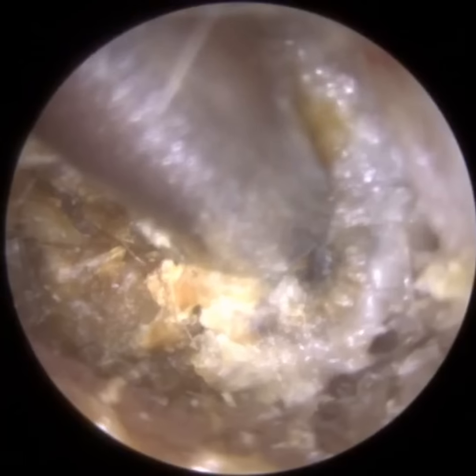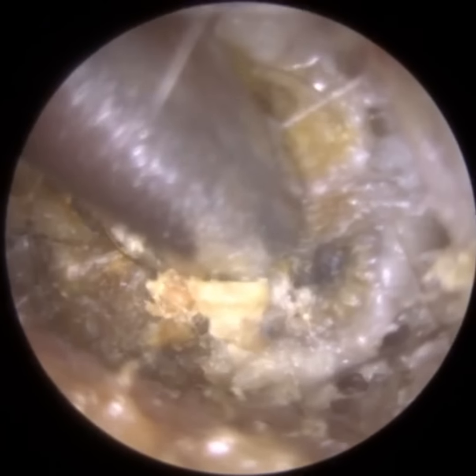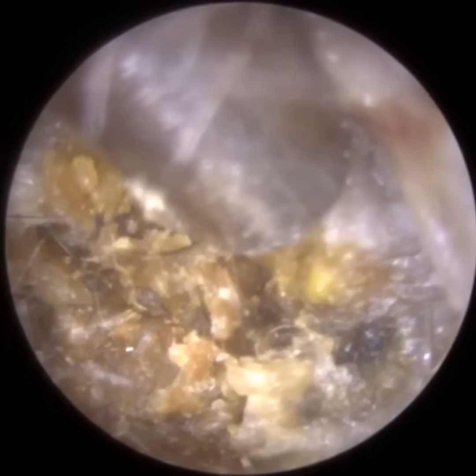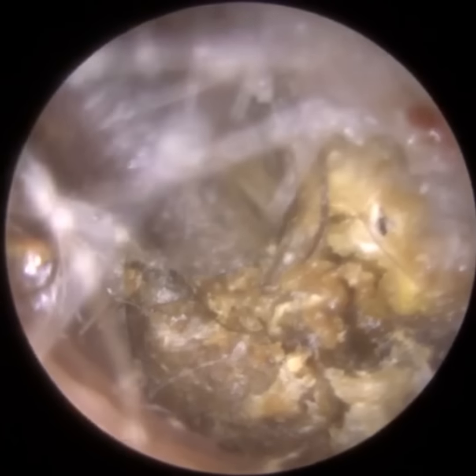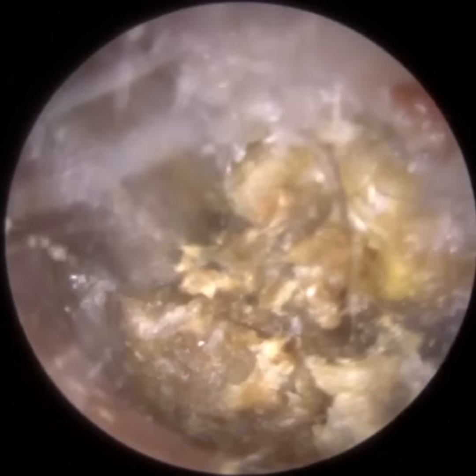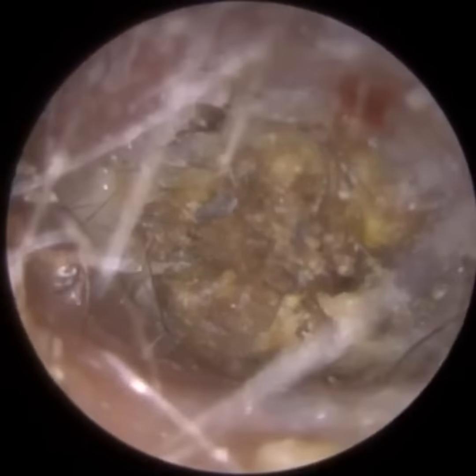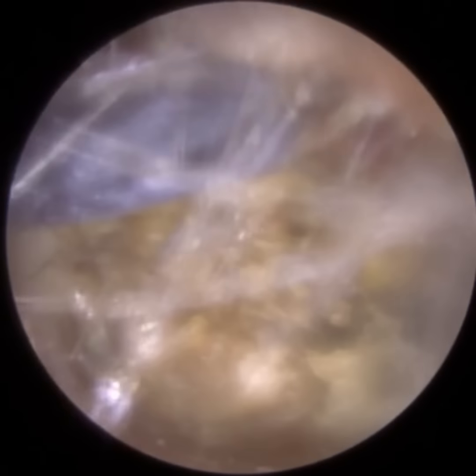And you can see here, I'm just trying to maneuver this plug, the skin adhesions. You can see the ear canal's narrow and it's widening, and that's due to this Keratosis obturans. It's expanded the ear canal, it's widened it. So it was quite difficult to remove. One of the characteristics of Keratosis obturans is that dead keratin like this is quite spongy. It's got a lot of kinetic energy.